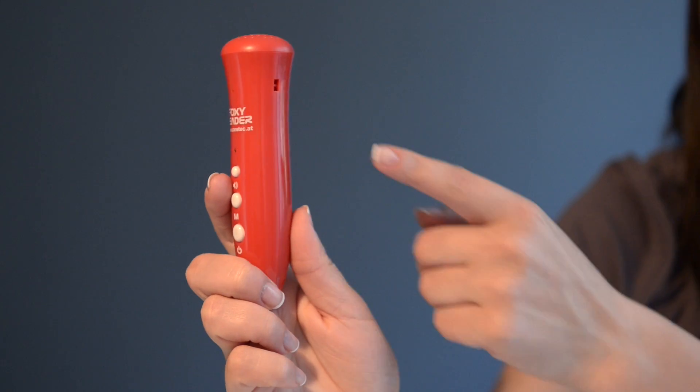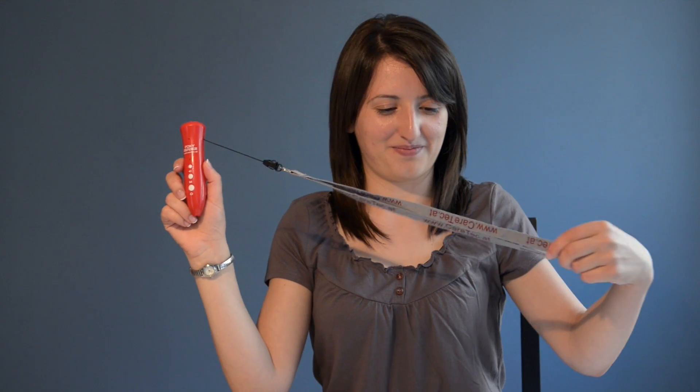Press and hold the top key for two seconds to listen to the acoustic user manual. When you're on the go, attach a lanyard to the side of the Foxy Reader to easily carry it with you.